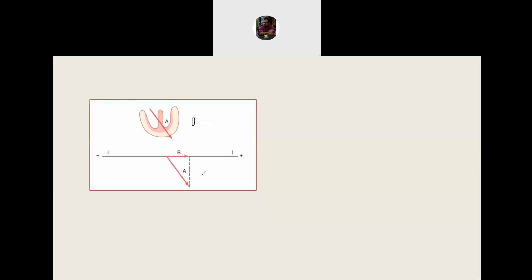Suppose this lead 1 represents the axis of the electrode and the actual vector that is passing through is represented by the vector A. Now, if A makes an angle of x with the axis of the lead, then obviously the recording on the lead will be A cos x. So A cos theta will be the component of that vector on the axis.